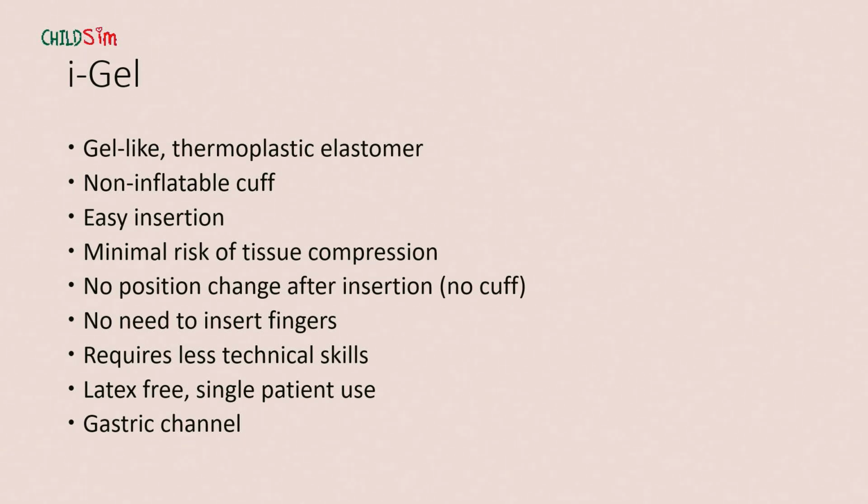And it is a non-inflatable cuff, with no need to inflate the cuff, and the insertion is easy, and there's minimal risk of tissue compression by overinflation of the cuff. And there's no position change after insertion, and there's no need to insert fingers. The insertion requires less technical skill, and the material is latex-free and for single patient use. And also there's a gastric channel, except for size 1 i-gel.